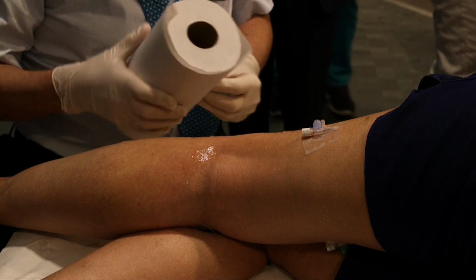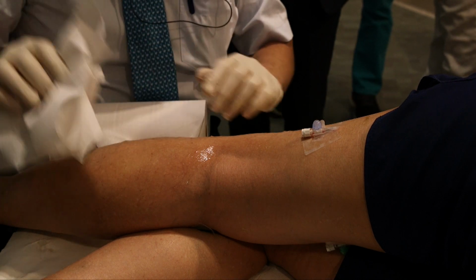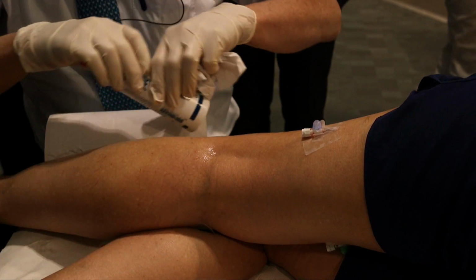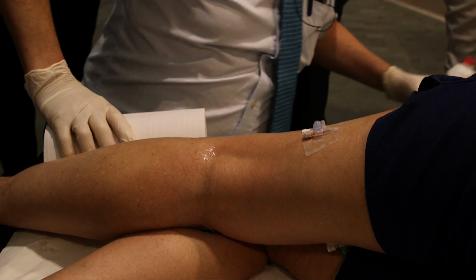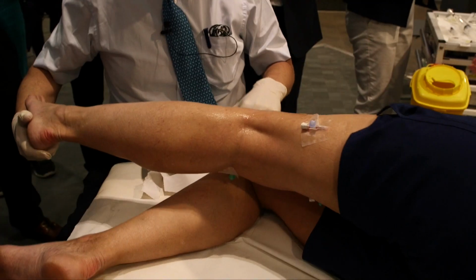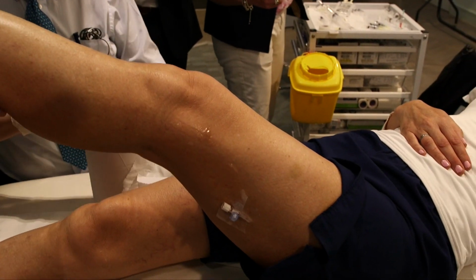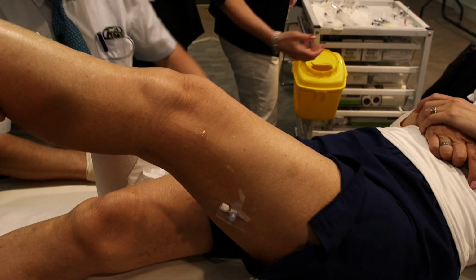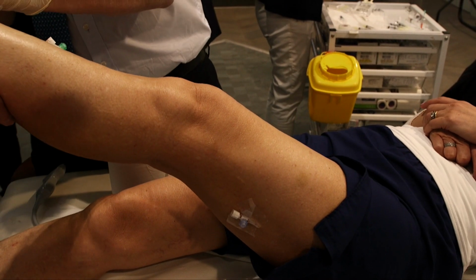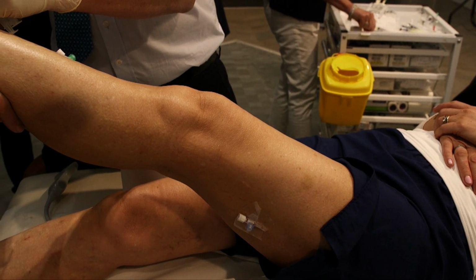So I think now we can do the holding up of the leg in the air. Kim, do you want to volunteer to hold the leg up? If you come and lie on your back now, Kim is going to pull your leg. Yeah, we normally use an unpaid assistant for this bit of the operation, the drip pole. But today we left the drip pole at home and Kim came to help. No, you're good, I think. You're not in the way of the camera. The drip pole is skinnier than you are.